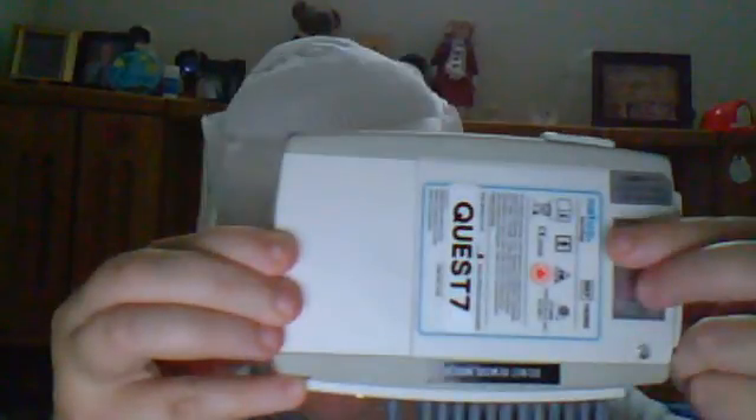I have to change the batteries every 24 hours. But luckily today I don't have to change the batteries because I get to take this off and take a bath later.